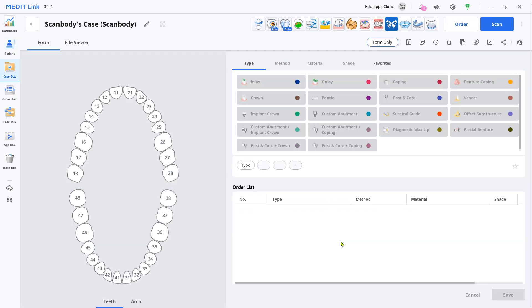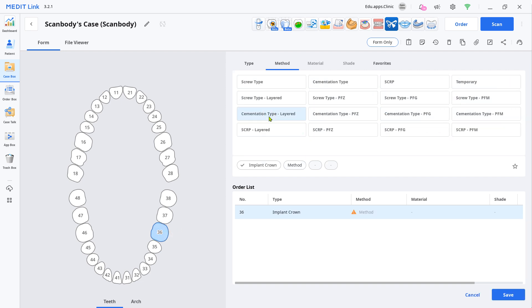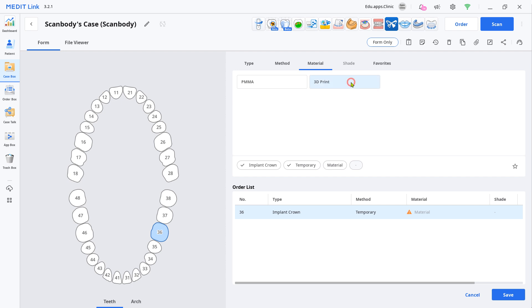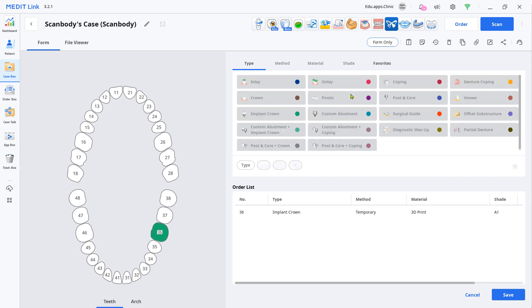Input the case information and click Register and Scan. Choose the target teeth number and choose Implant Crown, Temporary, and Shade. Have your scanner ready and click Scan.